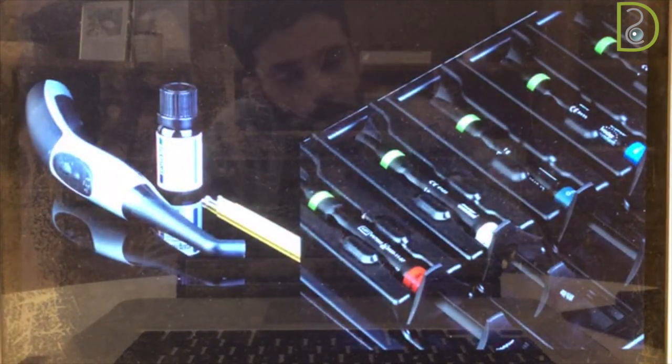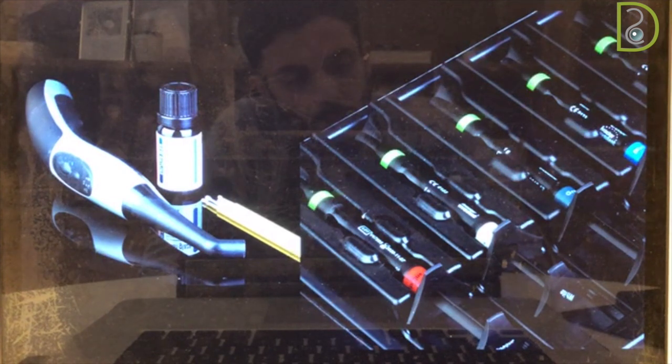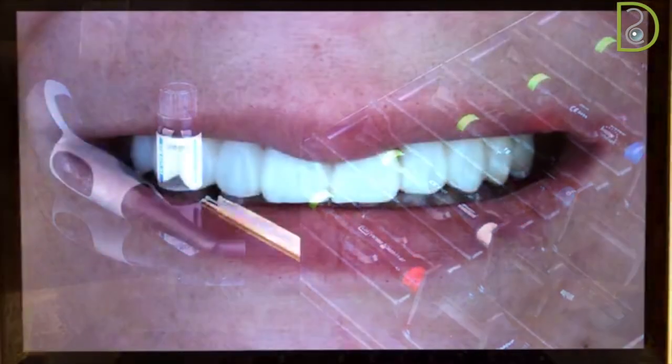Now, you can go back and start staining your kit. This is a very nice helpful kit from Ivoclar. Not all patients will arrive to your clinic seeking to restore all 6 anteriors or 8 teeth. Some of them might be there to just have 1 or 2 teeth. Now you're going to have to match it with the other natural teeth they have.